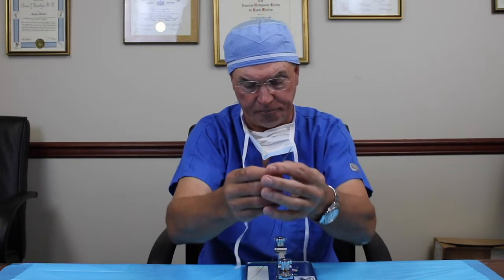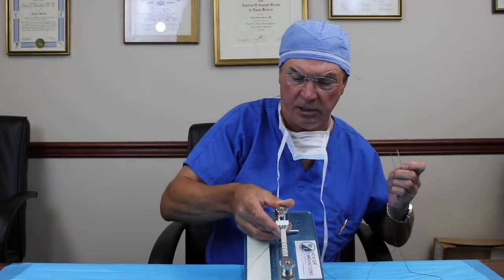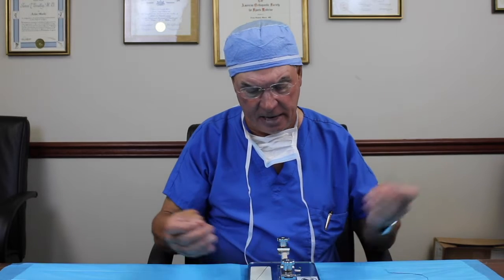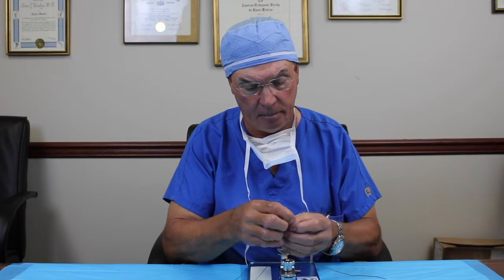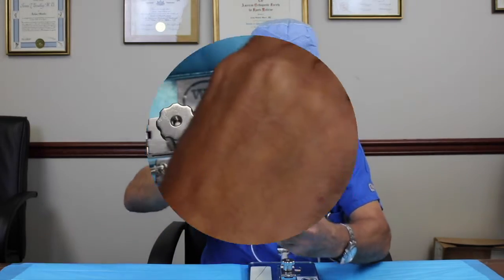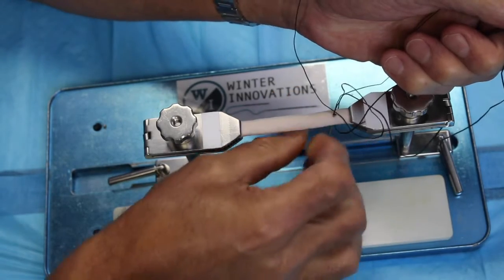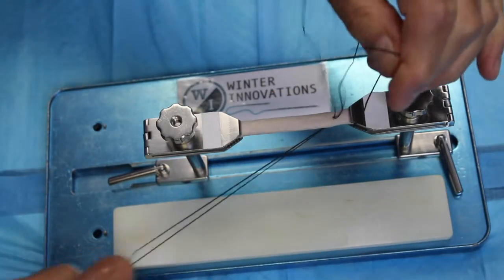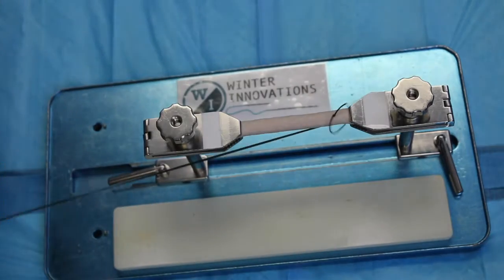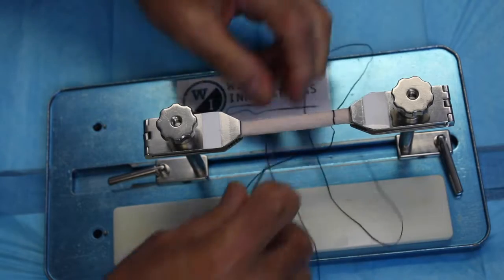So you simply can separate it like this. I've already done a little work on this one, and you simply just take it around the tendon, put it together, and then the second needle that I put in there is not sharp at all, so you're not going to hurt your fingers. And then you simply just grab it with both hands like this, push it right through the center, make sure you push the whole way through, and then you just pull it through like so, and you already have your first stitch.